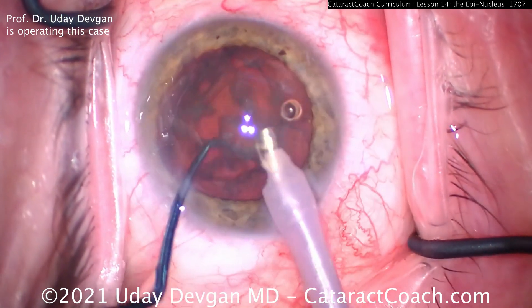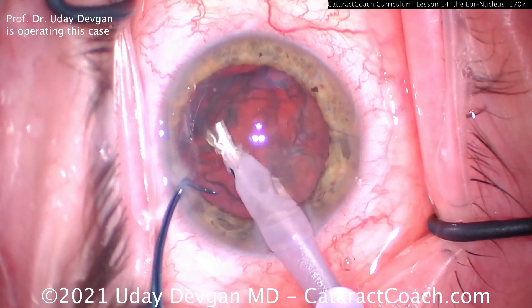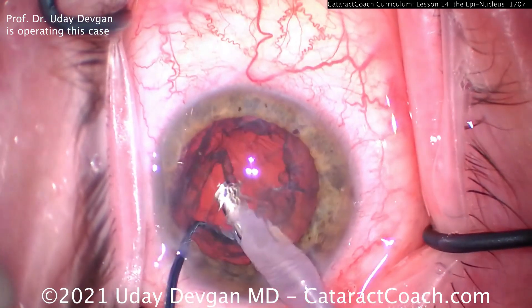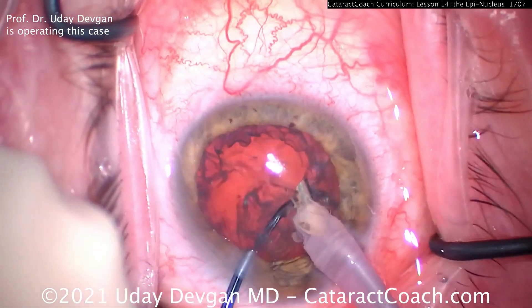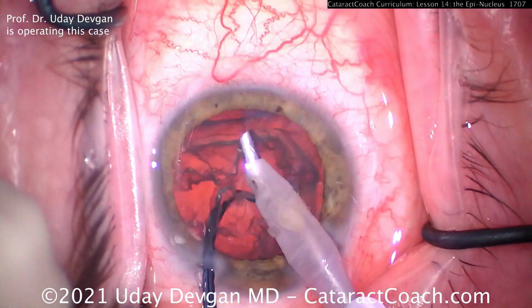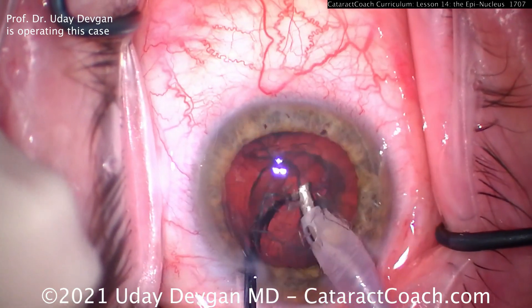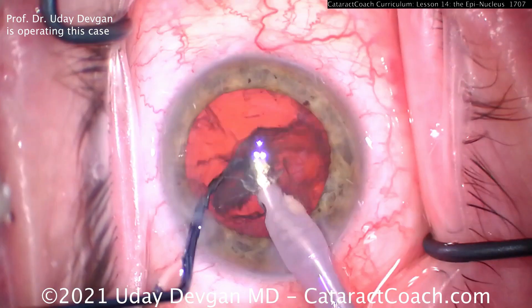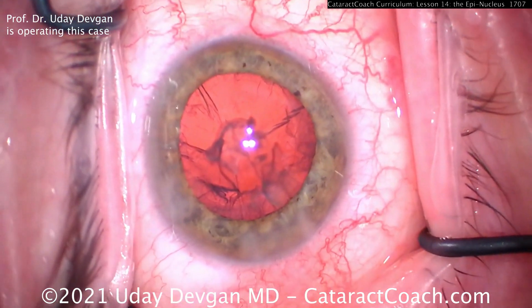This is a patient with about 2+ nuclear sclerosis. Now the nuclear part of the cataract is out — here's the shell. Using just vacuum, I don't change settings: 400–500 millimeters of mercury, 40 cc's a minute of flow, using the phaco probe in vacuum mode only, only pushing down a little bit on the pedal and never going into position 3. We try to aspirate the shell, rotate it around — all I need to do is grab an edge. Once that edge is grabbed, the chopper flips the epinuclear shell. Watch — the chopper pushes and flips it. Once it's flipped out of the capsular bag, we can wolf it down with the phaco probe very easily — all aspiration, no ultrasonic energy needed.